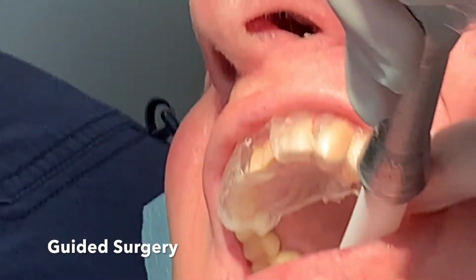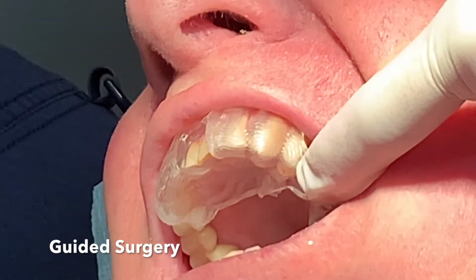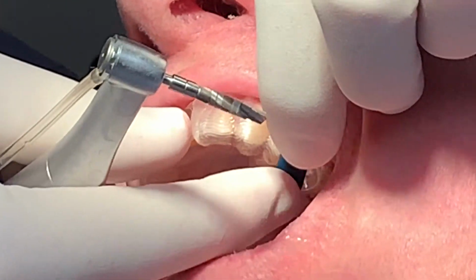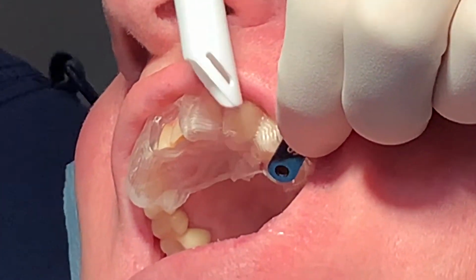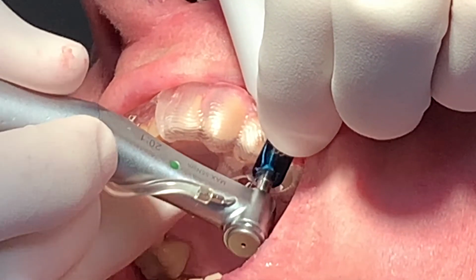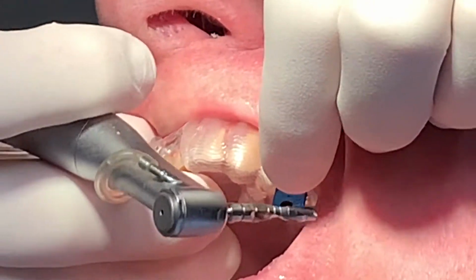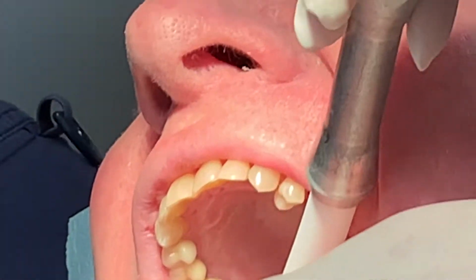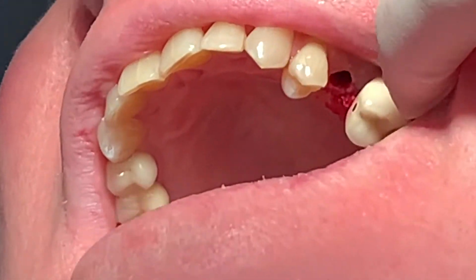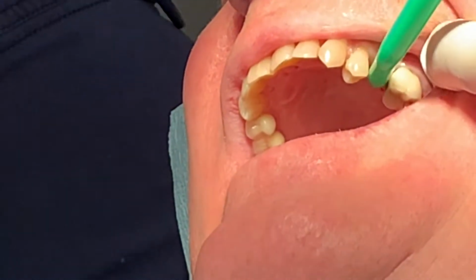So now we're just going to remove that punched tissue. And the 3.4, which steps down to 2.8. Open big. Okay. So we drilled the osteotomy at 3.4. And the bone is pretty soft, so I'm going to go ahead and try the implant in and see if it goes down to length.